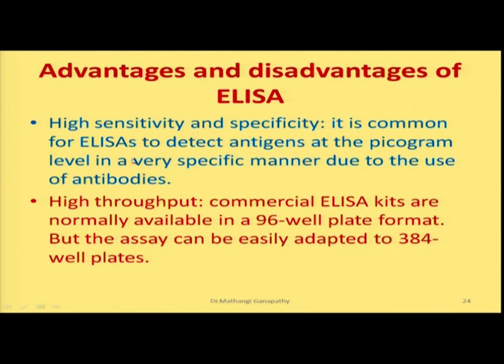Now, what are the advantages and disadvantages of this particular technique? ELISA is actually highly sensitive, and it is highly specific. So even when the antigen is present in picogram amounts, very little, it will be detected, because we are using specific antibodies against a particular antigen. So it will be very specific, highly sensitive.